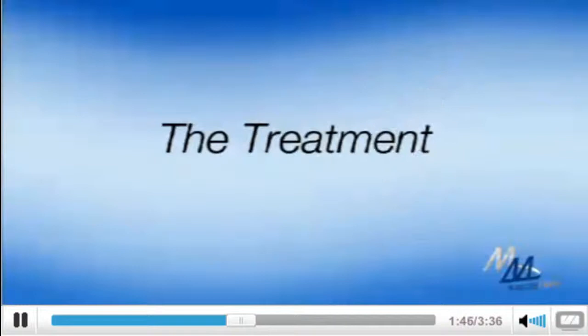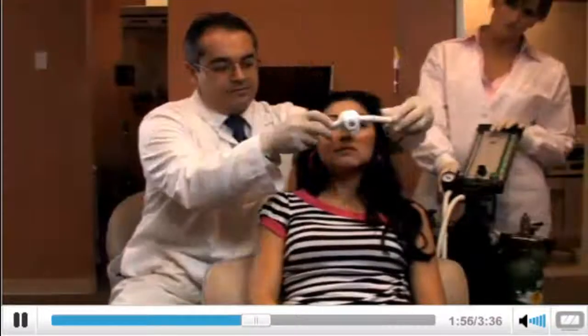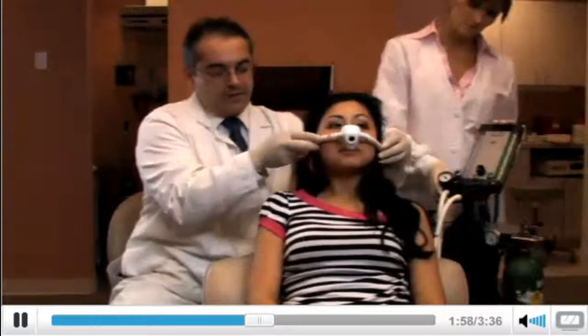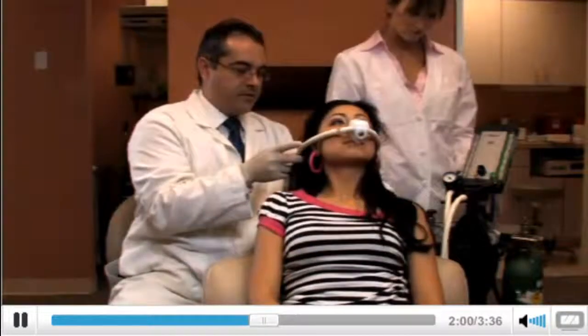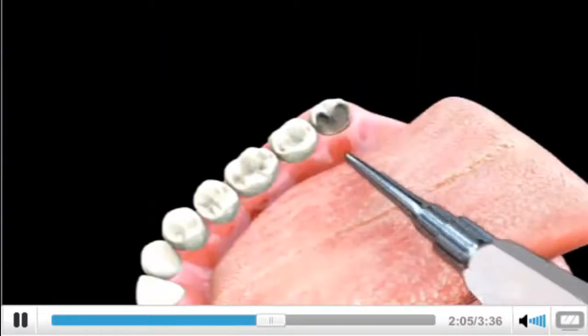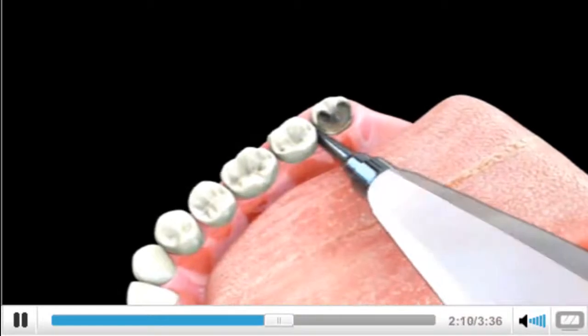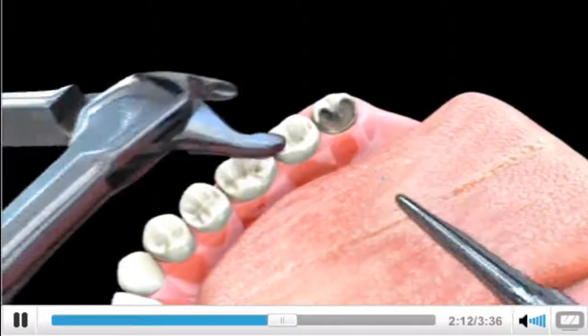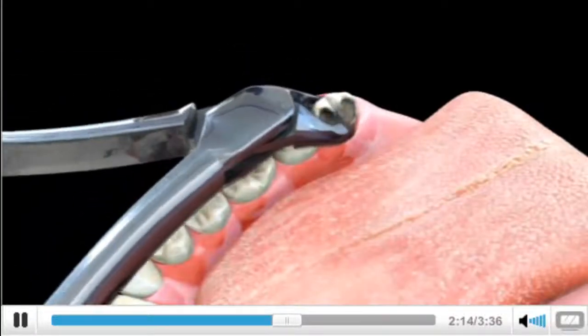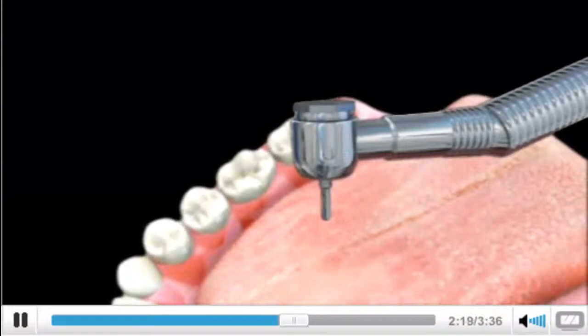Whether your dentist or a specialist is performing the extraction, the procedure is the same. First, a local anesthetic is given to make the procedure more comfortable. In some cases, your doctor may elect to administer nitrous oxide gas in addition to the anesthetic, or use a general anesthetic to put you under entirely. Once the area is numb, the extraction begins. A dental instrument, called an elevator, is used to wiggle the tooth in its socket. After the tooth is loosened, it is removed using forceps, or in some more complicated cases, a surgical handpiece is also used to assist with the removal of the tooth.